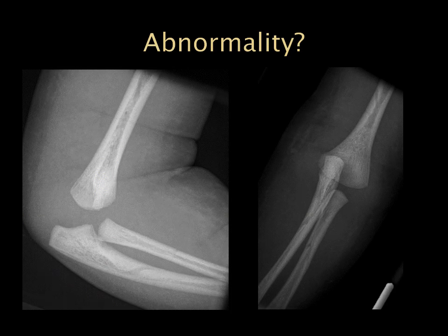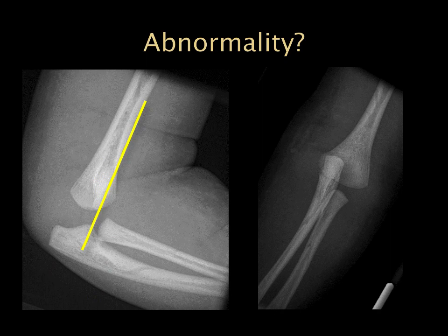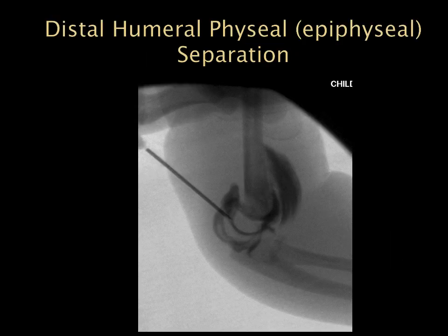In this very young patient — an infant — we don't see any ossification centers; everything seems bunched up. Drawing our anterior humeral line, we can see there would not be room for the capitellum or radial head ossification centers, so something must be going on. On the arthrogram, we can now see the outline of the non-ossified radial head and capitellum ossification centers, confirming distal humeral physeal or epiphyseal separation — essentially a Salter-Harris type 1 fracture that occurs in newborns or very young infants.